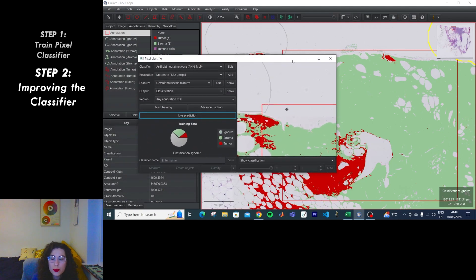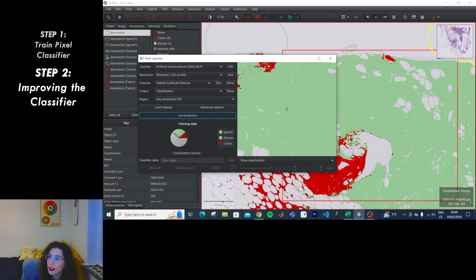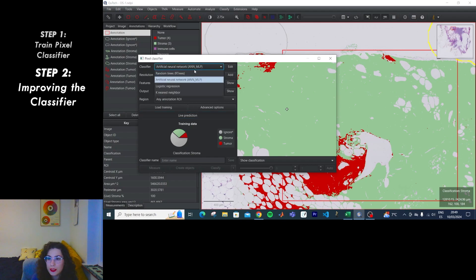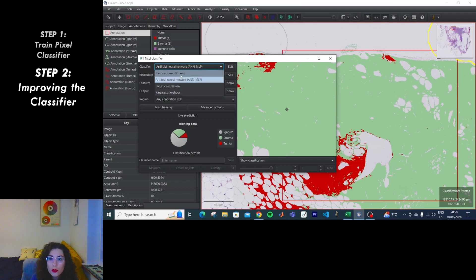The rest of the tutorial is all about how to improve classification. Three ways to improve are: choosing good regions for annotation and annotating effectively with small diverse training samples, having roughly the same number of training samples for each class, and playing with the classifier options. We have different classifiers: Random Trees, Neural Network, Logistic Regression, and K Nearest Neighbor. K Nearest Neighbor is apparently only a good choice if you're working with point annotations, otherwise it might take a really, really long time.